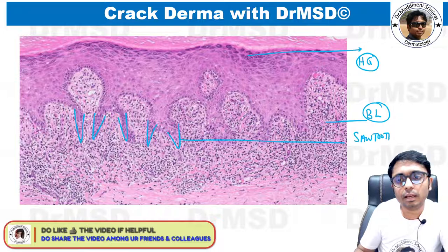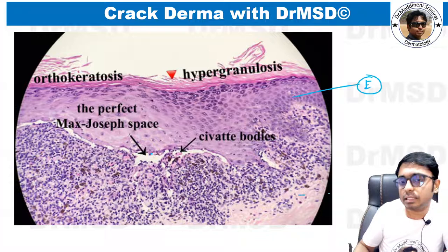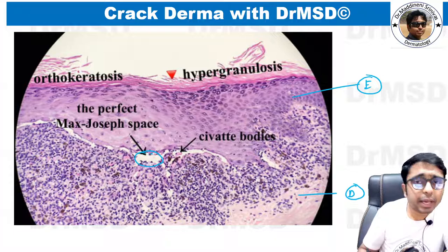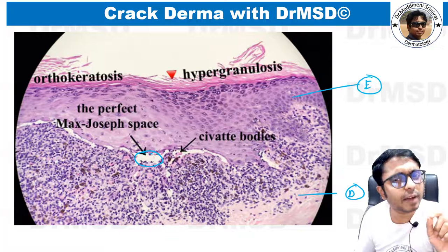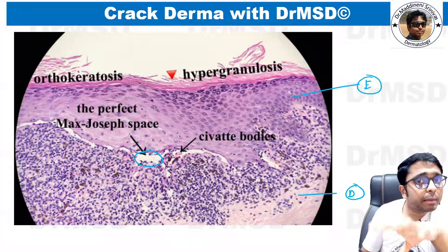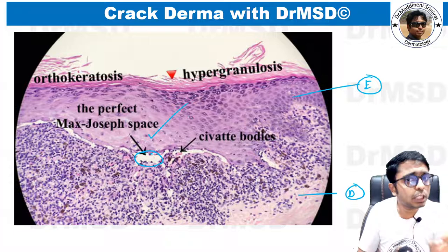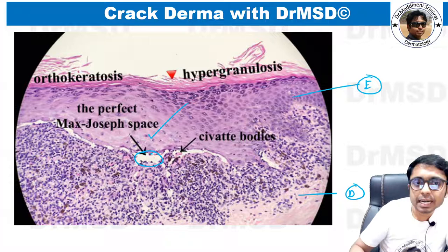If we further magnify the image, you can notice that at certain areas — the epidermis on one side, the dermis on the other — there are areas where the spaces are much more exaggerated. This is due to basal cell vacuolation. In certain areas of the skin this can be exaggerated, producing a big space or lacuna. These are given the special name Max Joseph space. This was the question asked, and the answer is lichen planus.